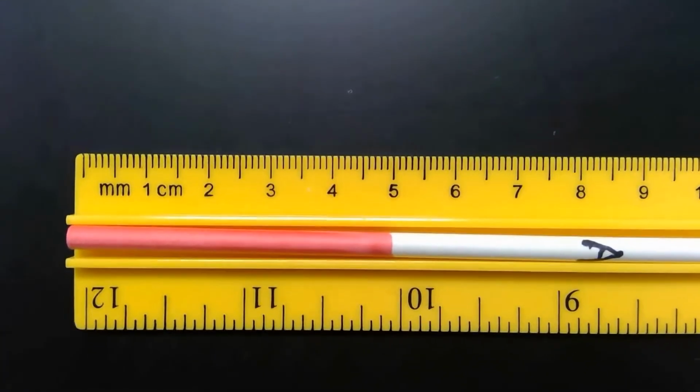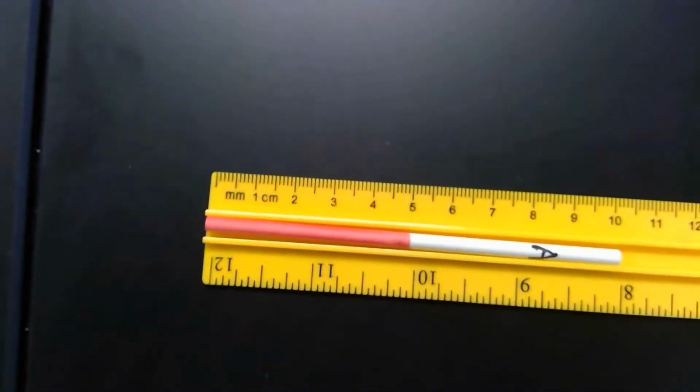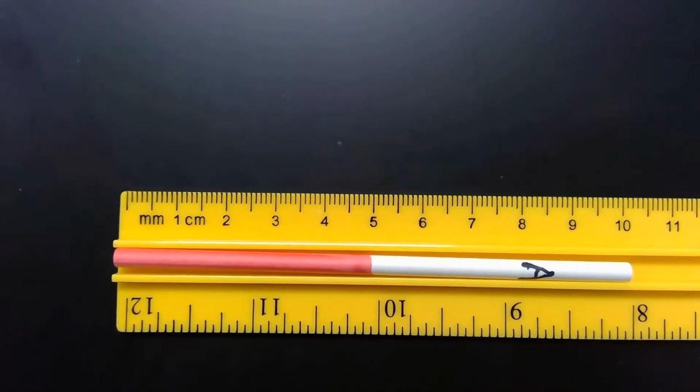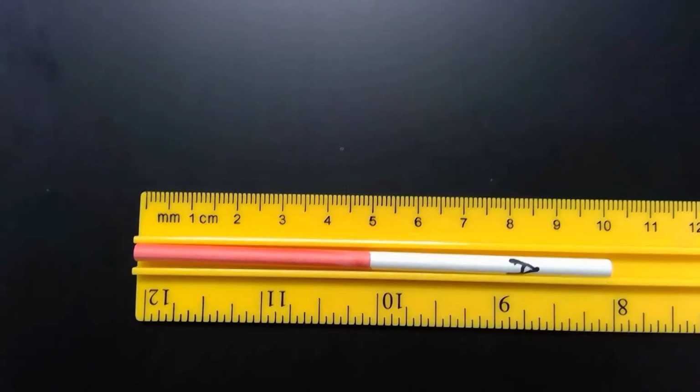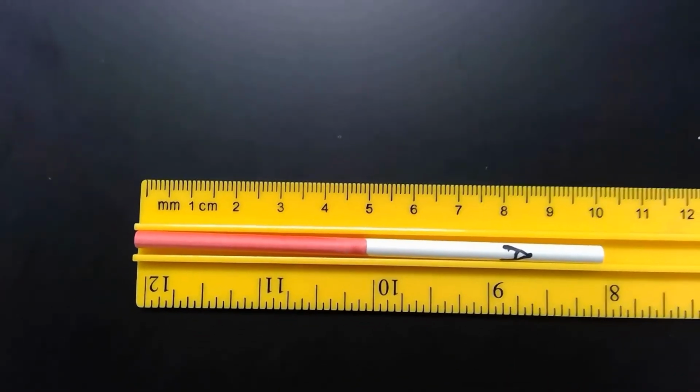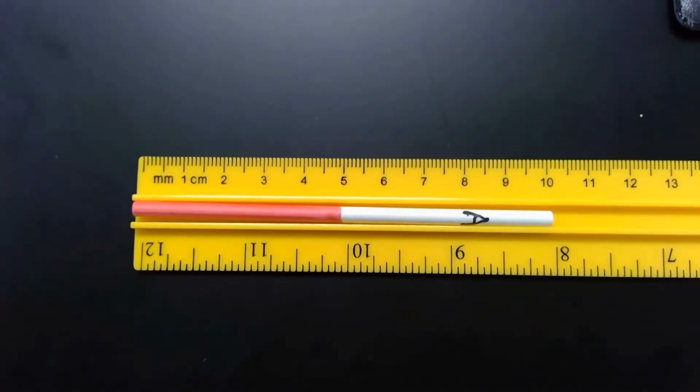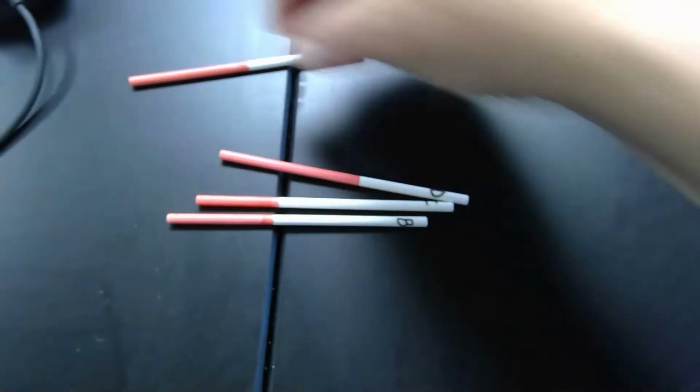You can see that the red comes up to the 5. So you have 10 centimeters of total blood, you have 5 centimeters of red blood cells. So 5 out of 10 is 50%. So this test tube has a 50% hematocrit. So you calculate the hematocrits the same way for the others.